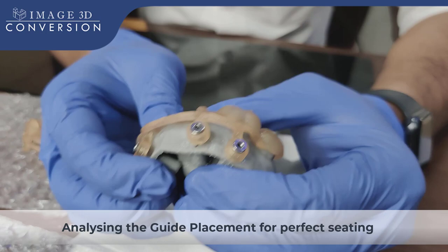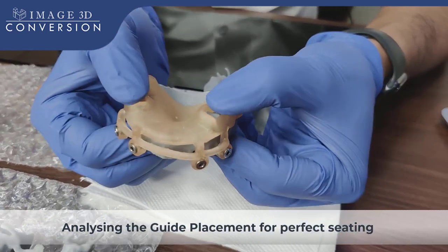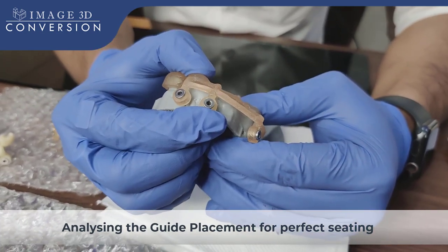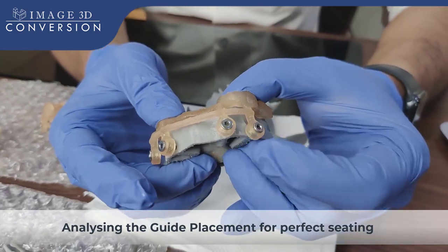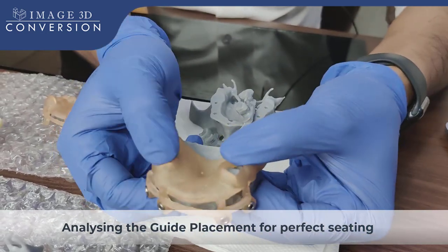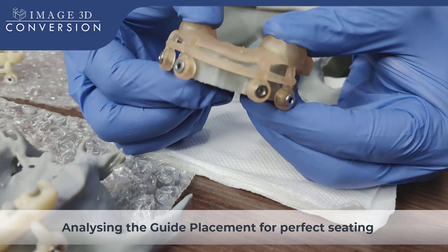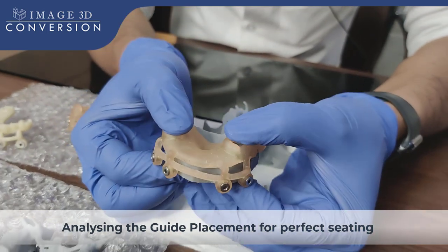So I'll stabilize the surgical guide. If I give pressure on the pre-molar, I find that all the fixation pin positions are the same as what we planned in the software, and the same fixation pin and indexing pin positions can be achieved in real-time as well. While stabilizing this surgical guide and giving pressure at the pre-molar window, I'm getting the fixation pin in the right position. That means my guide is accurate.